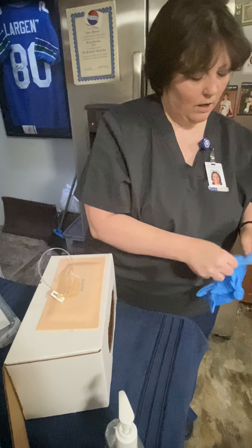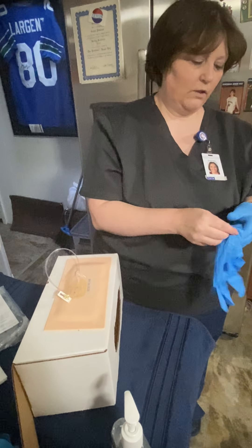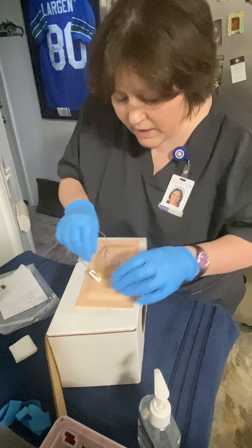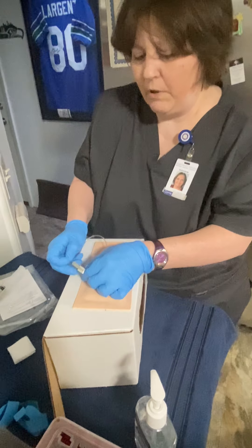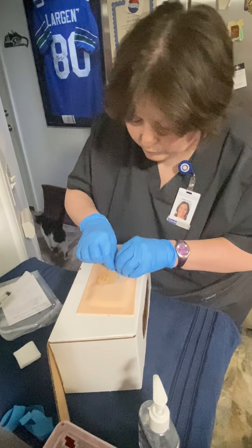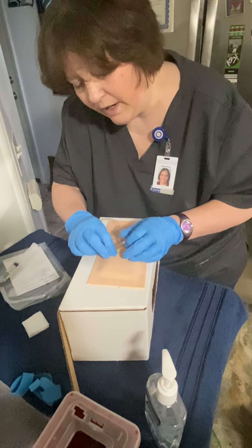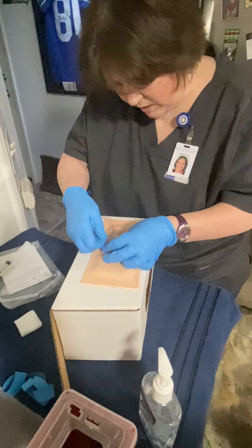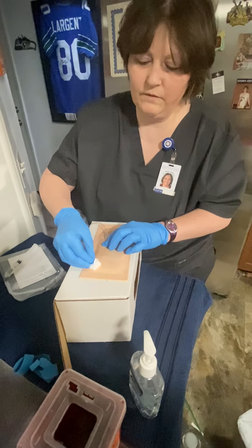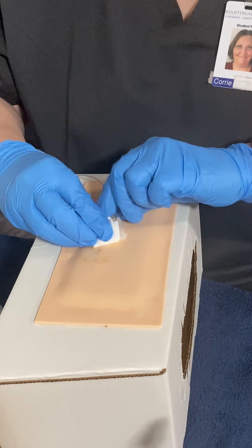I'm going to put my gloves on and I'll be as gentle as I can because I know that the tape is on your arm hair, so I'll be careful with that. The first thing I'm going to do is take this dressing off — but I'm not going to remove the catheter at this point. I just want to get it all in one place so that when I'm ready it comes off nice and easy. Sorry about the hair. Now I'm going to put this gauze dressing on, fold it in half and then in half again, and place it right where the catheter is going to come out.